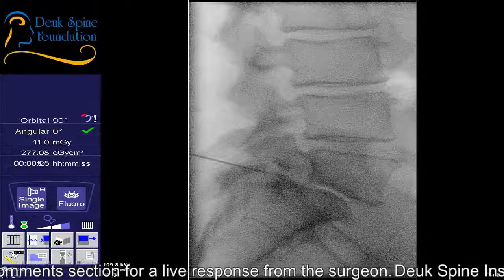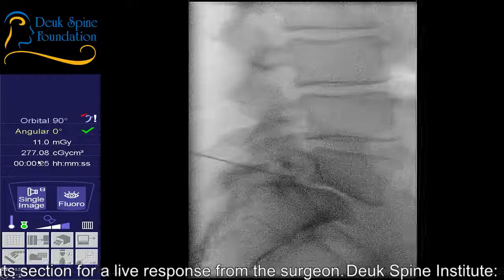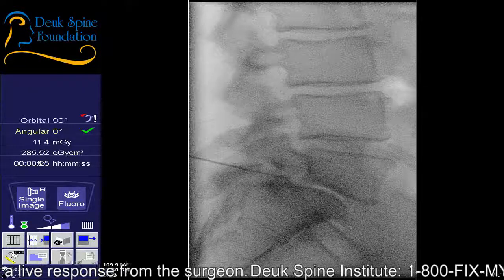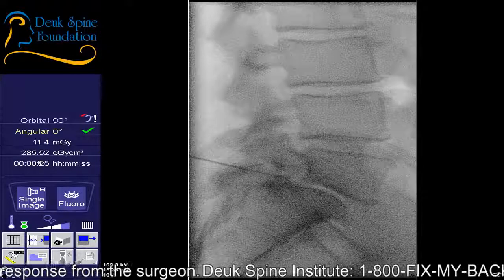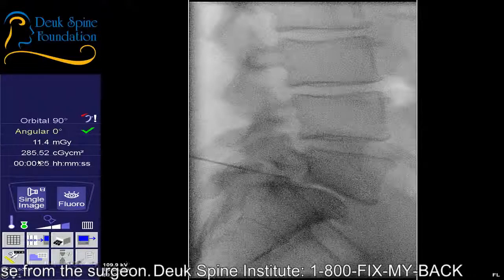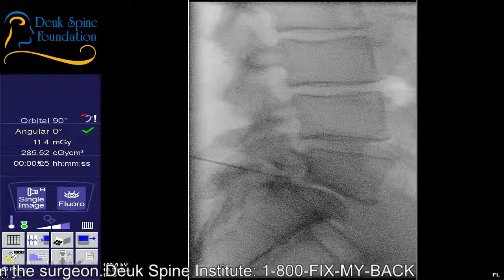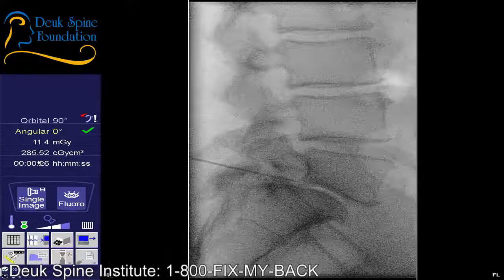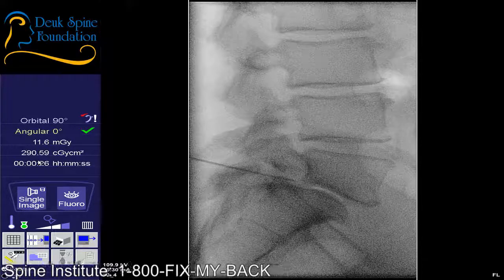Any discomfort? Those ones you were doing just before the last one, yeah. I could feel it, touching whatever it was. There wasn't any sharp pain, but I could tell you were there. Yeah, I was close. I'm not as close yet, but I will be in just a second.